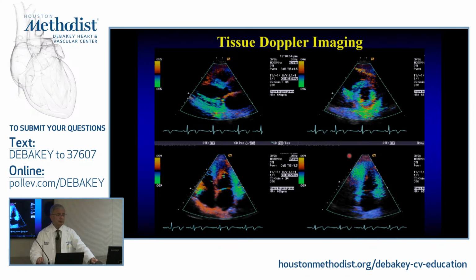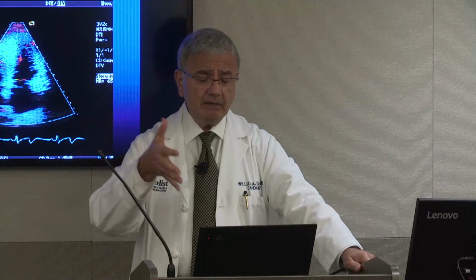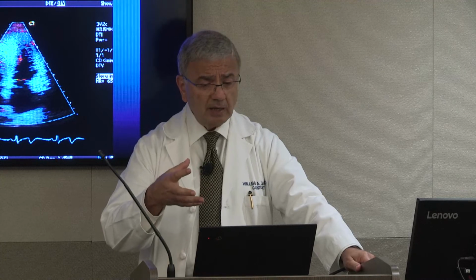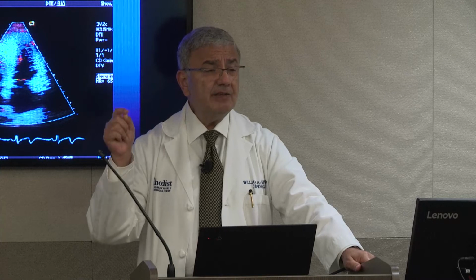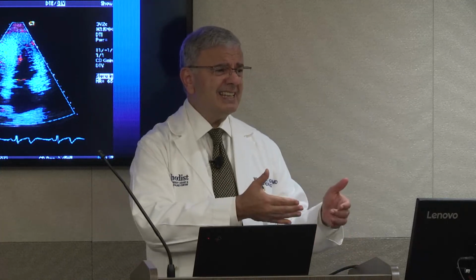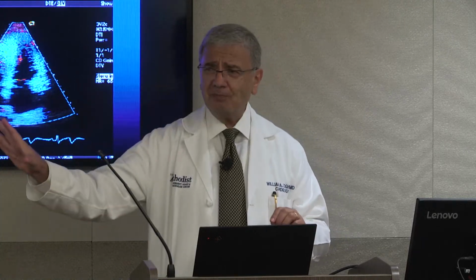Tissue Doppler, very important. Tissue Doppler, in the past, we wanted to ignore it. We don't want to see it. And the interesting thing is it's very different than flow Doppler, blood flow Doppler. Why? Because the intensity of the Doppler signal is very high and the velocities are low, as opposed to blood. Intensity is low and velocity is high. So it's very easy to decide, oh, I want to ignore muscle.